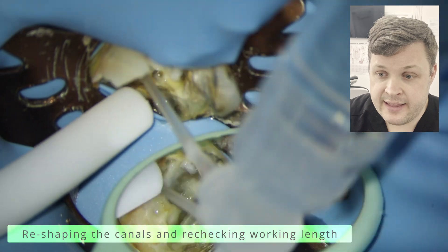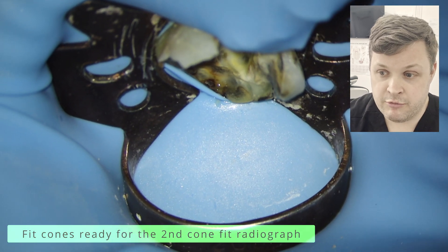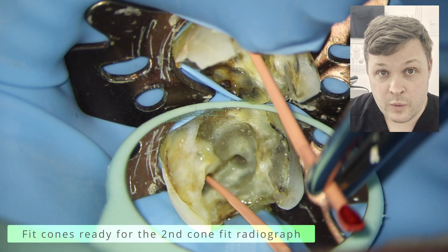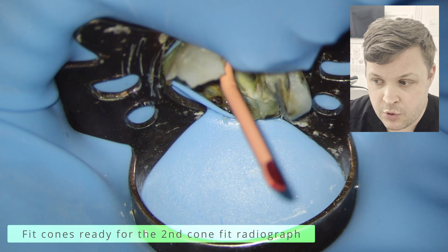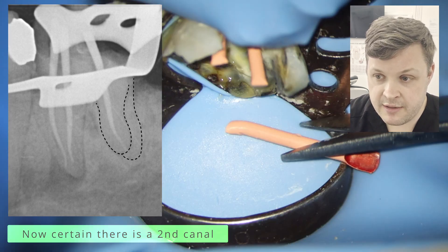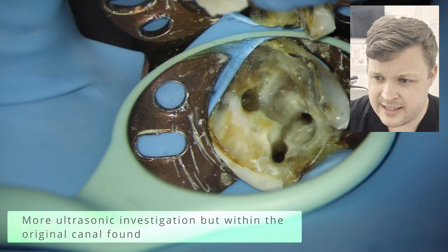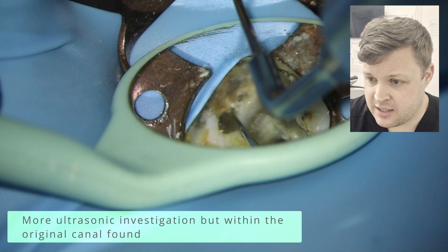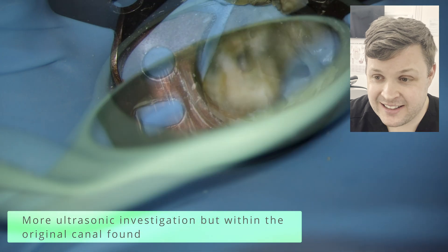We're fitting the cones ready for the cone fit radiograph. I'm a big proponent of retaking cone fit radiographs — I don't like being a bit short or a bit long and just making an adjustment and filling; I always like to check with as many radiographs as possible. Once we take them, all cones are nicely to length. I'm almost adamant now there is a second canal, so rather than searching where I was before, I think I should look for a split within the main distal canal. Removing some more dentin, it just reveals the second canal.